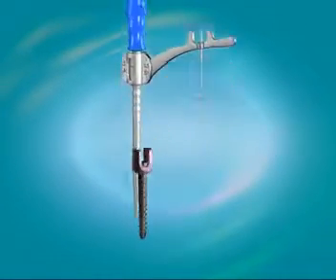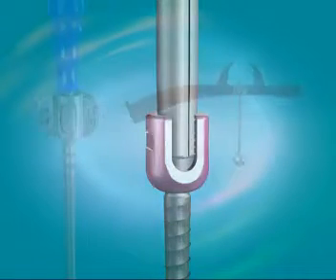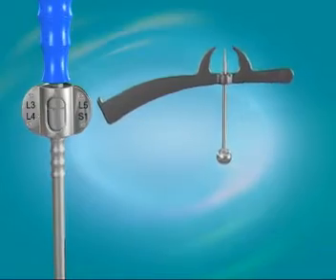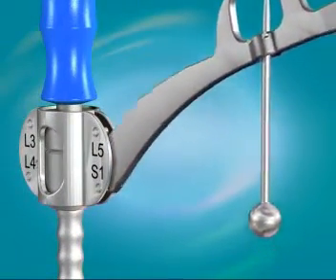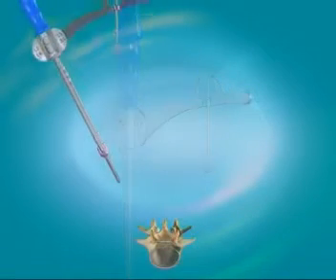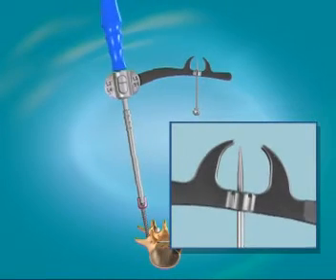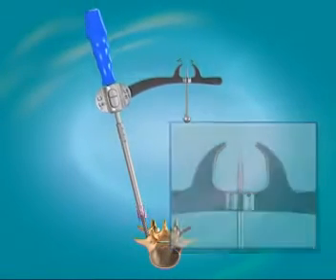Place the pedicle screw at the tip of the screwdriver and lock it in place with the sleeve. Place the universal pendulum in the appropriately marked wing corresponding to the vertebrae being operated on. Insert the pedicle screw under X-ray guidance while maintaining the pendulum marker within the ± 15 degree margin.